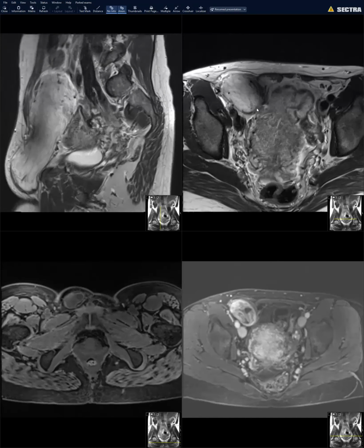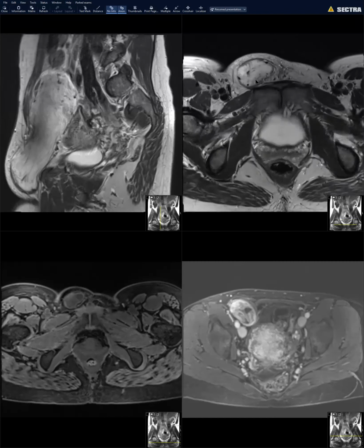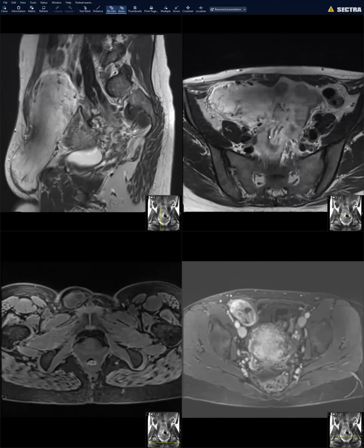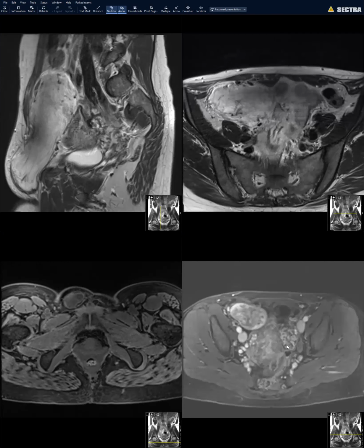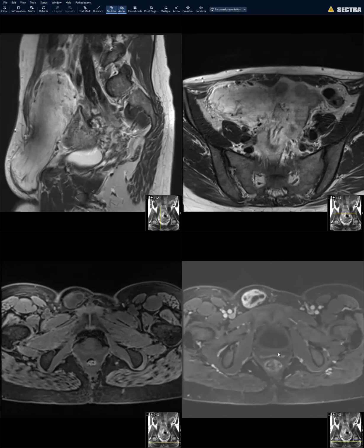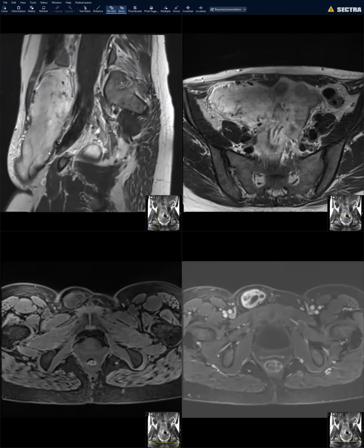So multi-compartmental, like Steve said, it looks like a hernia or a hydrocele of the canal of Nuck going into that labial region. I think last time we brought up an aggressive angiomyxoma because it can have that lamellated appearance, but this is an unusual location. That's a good thought also. Those are again fleshy looking multi-compartmental tumors which can have this lamellated appearance.